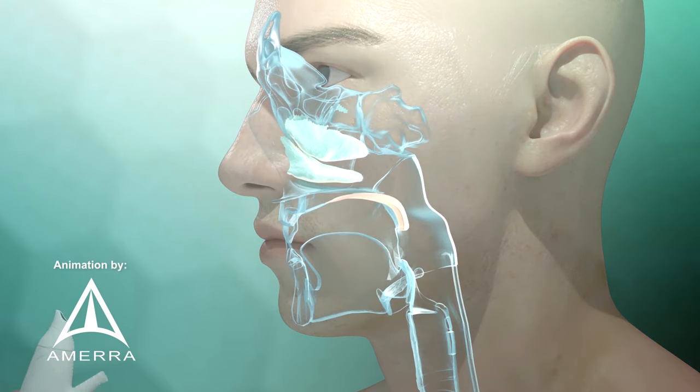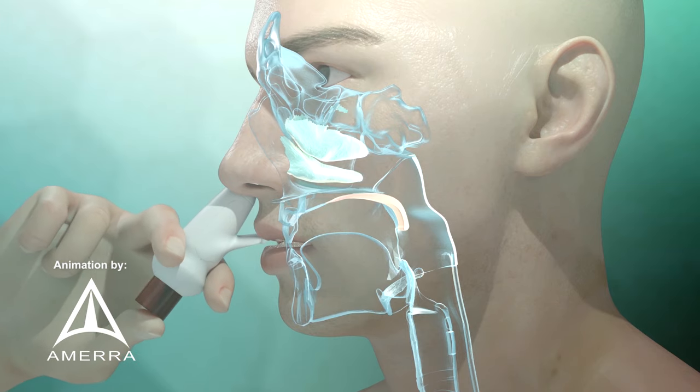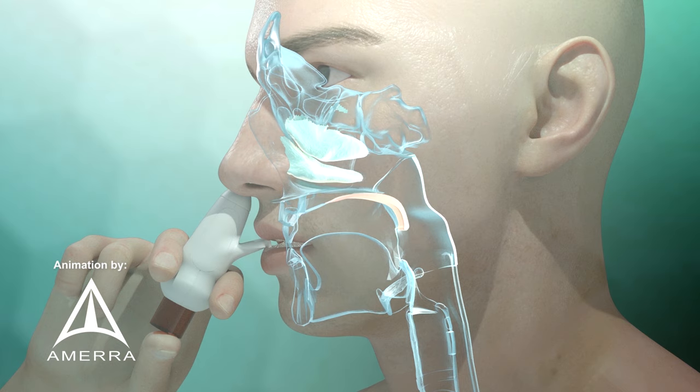In the exhalation delivery system with fluticasone, the nose piece seals tightly in the nostril, acts as a stent to open the nasal valve, and transfers pressure from the lungs and mouth to the nose and sinuses.